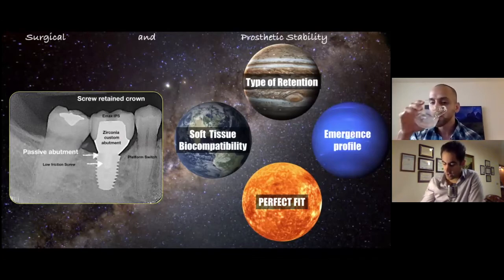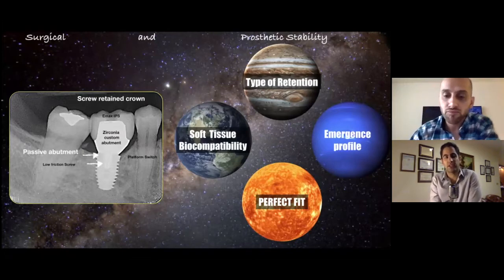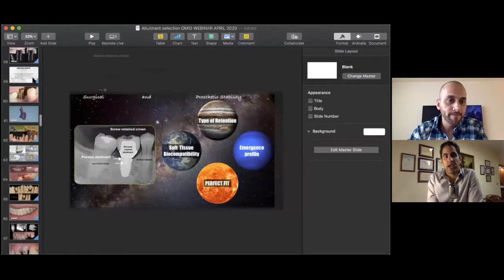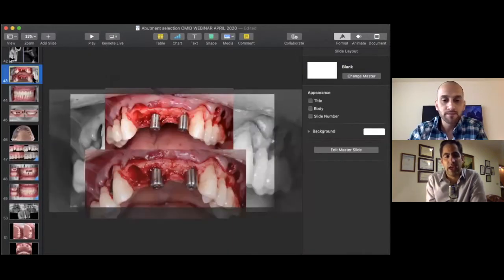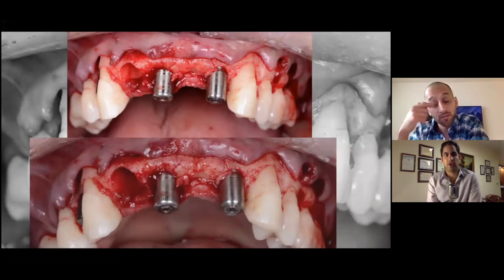Sure, Safa. One of the things I first wanted to ask was about the case in the anterior maxilla, the case where you extracted the two centrals and the left lateral and the right lateral also, and you placed your implants at the area of number 8-10. Right, incisor. Yeah, this case. So one of my first questions regarding the planning is, why did you decide to put implants in the area of central and lateral and not place implants in the area of the two laterals?